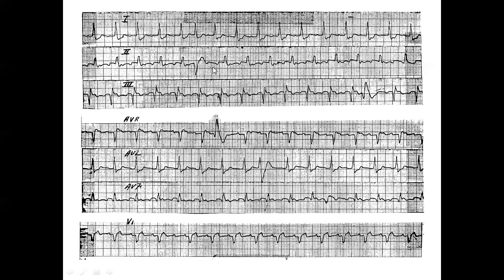Only one lead, Dr. Wang, the flutter, because if I just looked at V1, well, flutter wave is best seen in the inferior lead, so I put which lead it is. It's in lead 2. That's where you see the flutter wave best. So are you all comfortable in calling this? Oh yeah, I see it, flutter wave. What do you think? Jessica, are you comfortable in calling it flutter wave?